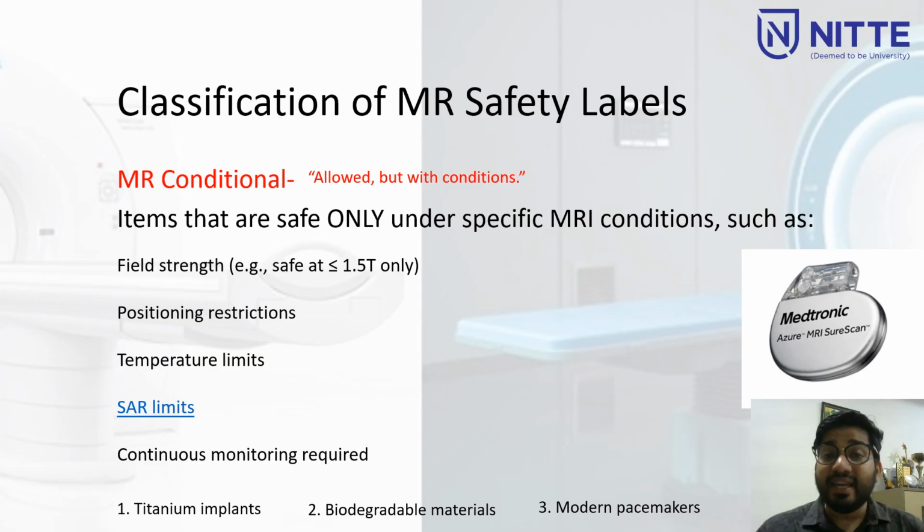And when we come to the pacemakers, specifically modern pacemakers, in conventional pacemakers we can't use, that I will explain in a further slide. In modern pacemakers we have to ensure that the MR mode should be on.